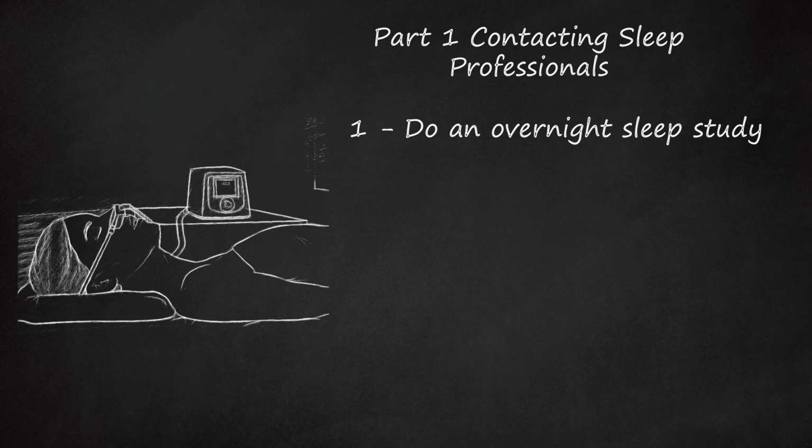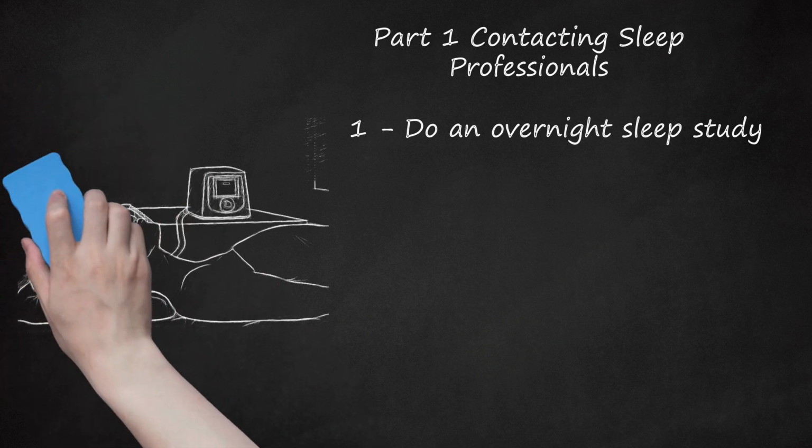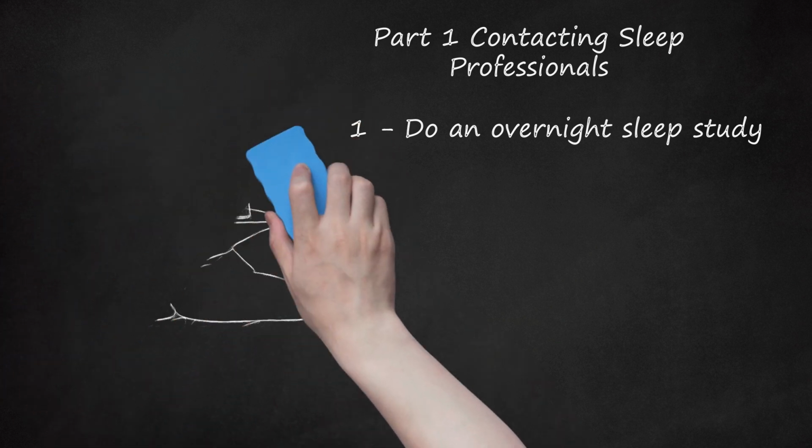Sleep clinics typically do not recommend that new CPAP users change their pressure settings until they've had their first sleep study and use the prescribed pressure settings for several weeks at minimum. While you are in the sleep lab, the doctor or sleep specialist may also measure your activity levels and movement as you sleep, record your brain activity, eye movements, blood pressure, heart rate, and blood oxygen levels, and fine-tune the fit of your mask and the air pressure settings.